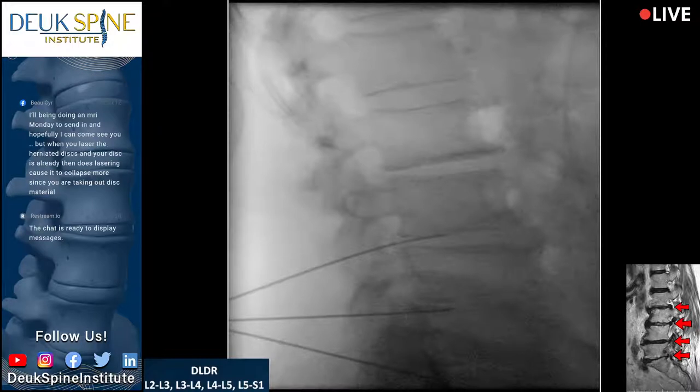Yes, we do have a question from Seer on Facebook. Great. Does the laser cause the disc to collapse even further, or does it retain the disc?